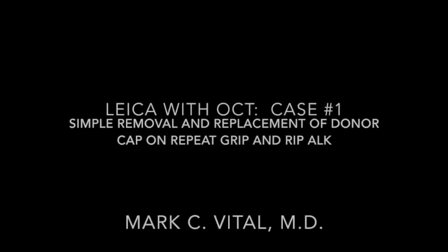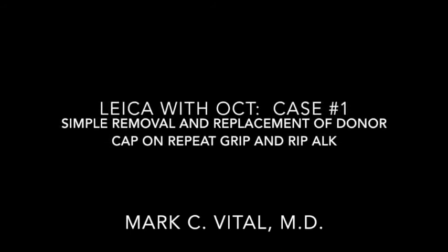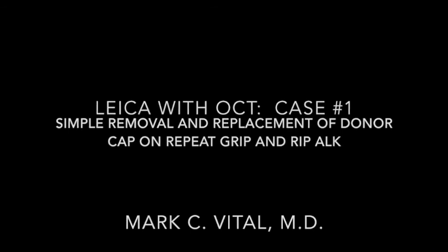I'm Mark Vidal with Houston Eye Associates and would like to present this video to show the benefits of the intraoperative OCT on the Leica microscope and how it shows: 1) the quality of the interface of the grip and rip technique for ALK, and 2) the relationships of the donor cap and recipient bed.